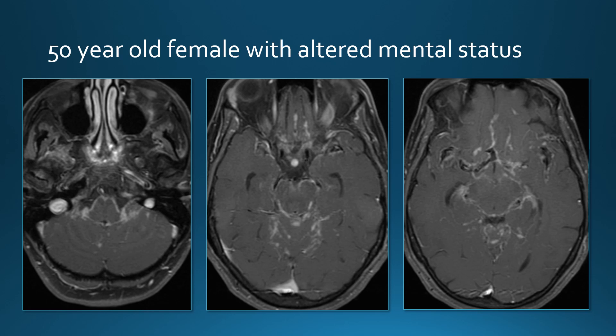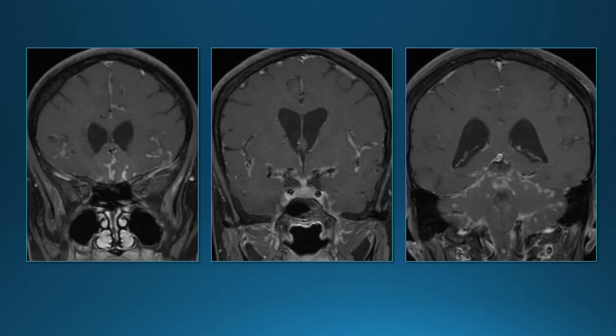A 50-year-old woman with altered mental status also has extensive leptomeningeal enhancement — seen along the brain stem, within the cerebellar folia, along the midbrain and basal cisterns. On coronal images, we see leptomeningeal enhancement along the optic chiasm and pituitary stalk. This is a patient with sarcoid.